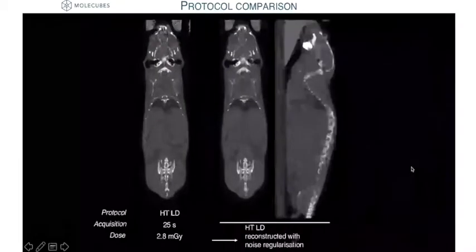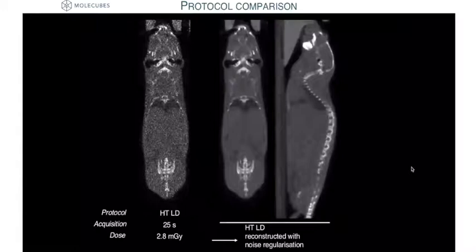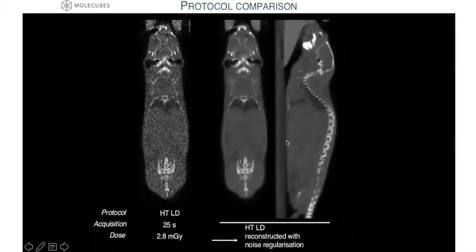The images maybe become a little bit noisy, but then you have with the X cube the big advantage that you can use an iterative reconstruction algorithm, and during this reconstruction you can also do some kind of denoising based on total variation. Then you have an image which is, in my opinion, sufficient to combine with the SPECT or PET image to provide some anatomical information.